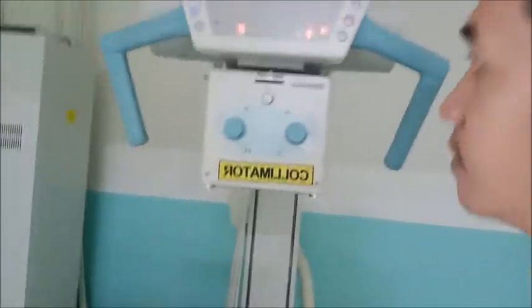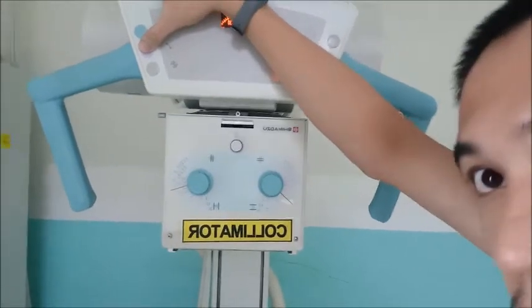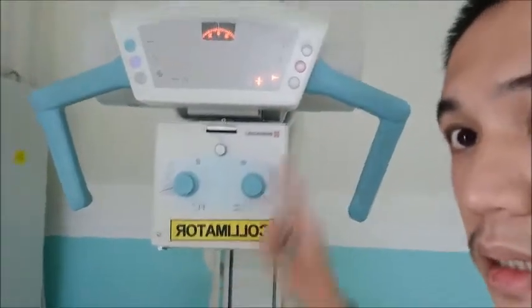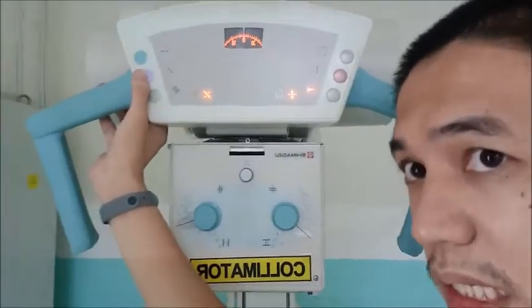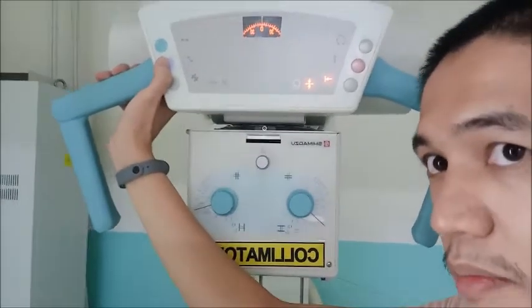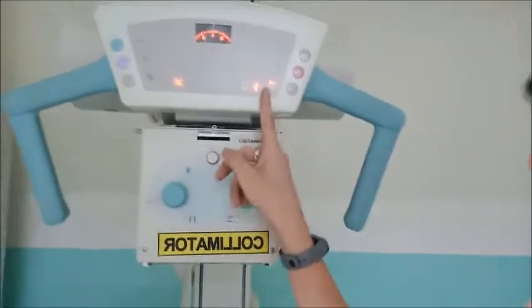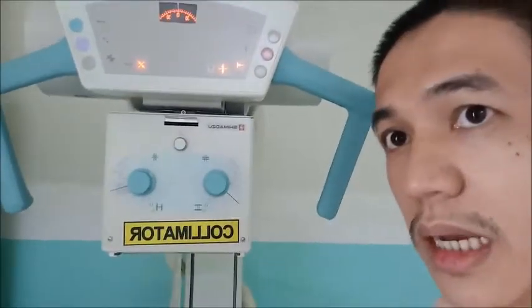Okay. So, kung i-move na siya, mapalong na siya. So that means nag-misalign na sila. That causes misalignment. Siga siya balik. Yun siya forward padulong dire. So nawala na po diyang alignment. Balik. Yan siya. So 40 SID, center na siya sa ato ang IR.